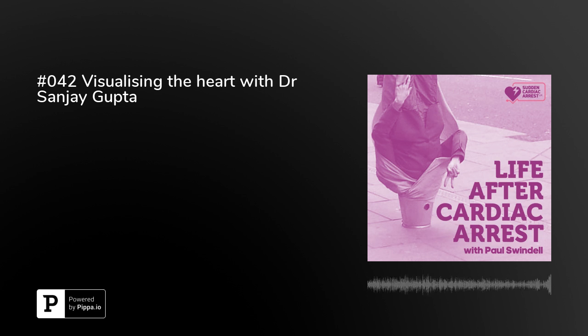So cardiac imaging. So what are we talking about there? We're talking about modalities which allow us to visualize the heart and the arteries surrounding the heart. So visualizing the heart, both to make a diagnosis, to tell you about the health of the heart, and to also guide you about prognosis.